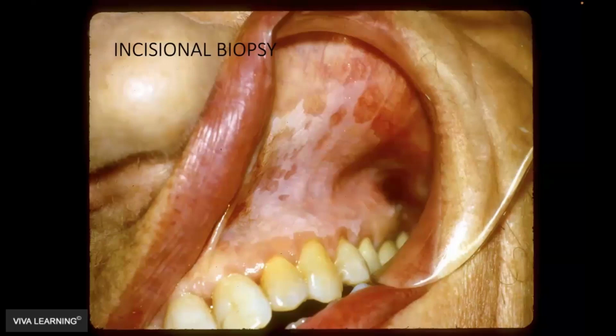So this is a patient that had this white patch from pterygomandibular raphe to pterygomandibular raphe, maxilla, mandible, floor of the mouth, all over. You would not sit this patient down and remove this entire lesion unless you know it needs to be removed. And the only way you would know it needs to be removed, once again, is via biopsy.